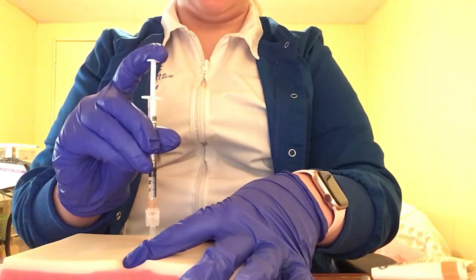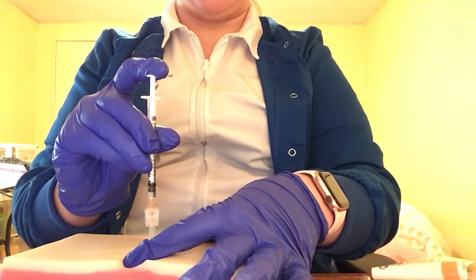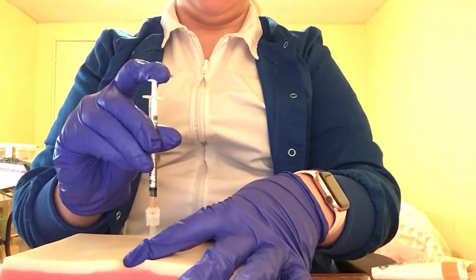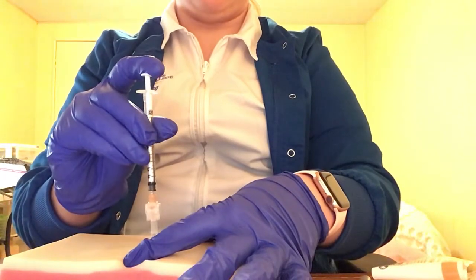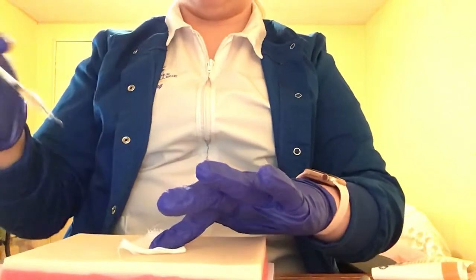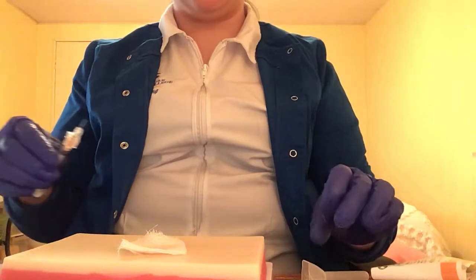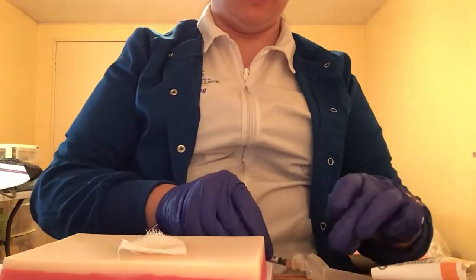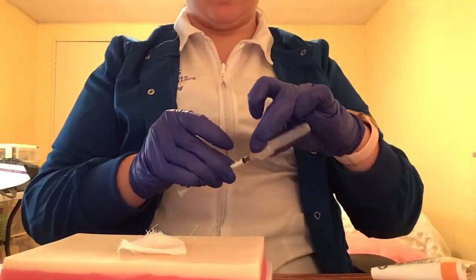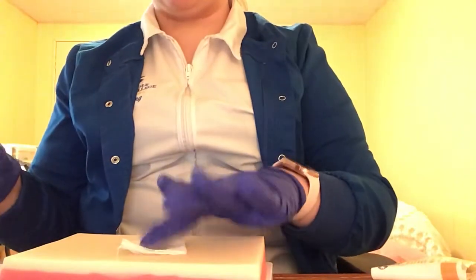Now, if Anna were too skinny and I was not able to pinch an inch, I would go in at a 45-degree angle with this needle. And this one I can remove right away. I would remove and put some gauze there in case there was any bleeding, and I would passively recap my needle. Now I do recognize I had to grab my syringe with my hand, but that's because my fake skin likes to shoot water everywhere, so I had to do something about it real quick.